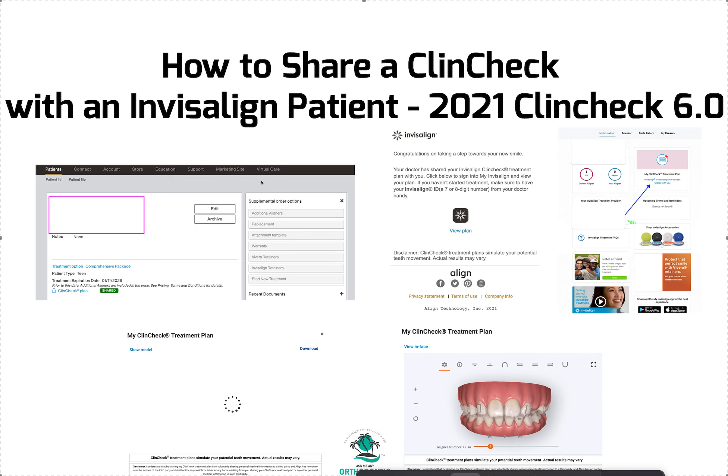Hey, it's Dr. Amanda with Straight Smile Solutions, straightsmilesolutions.com. And today we're going to talk about the new way to share ClinCheck with an Invisalign patient.